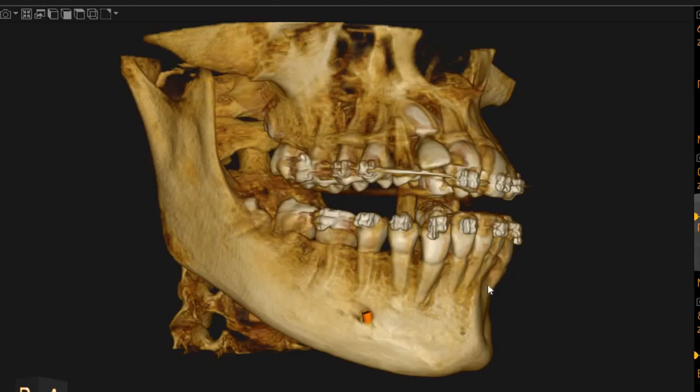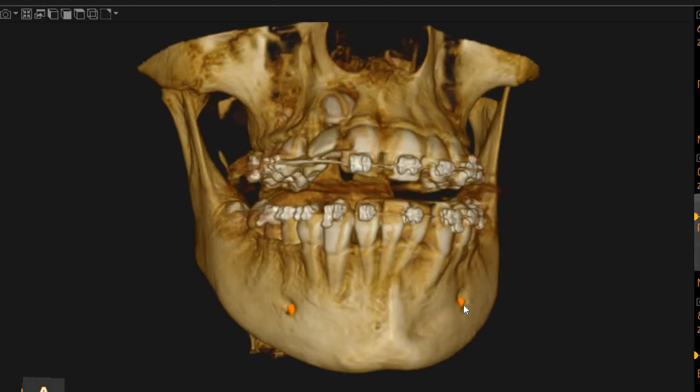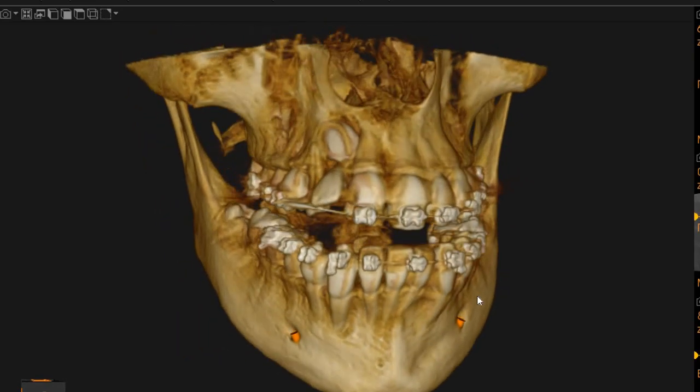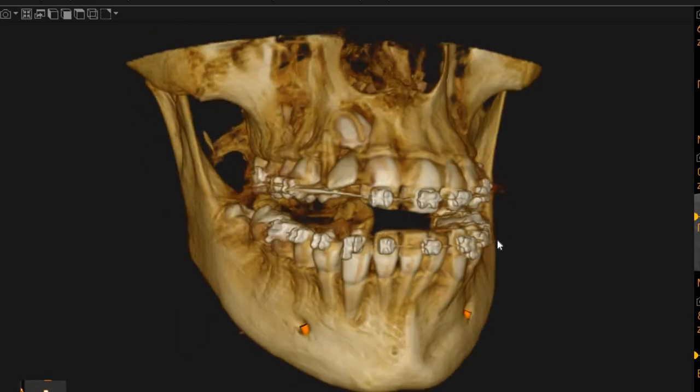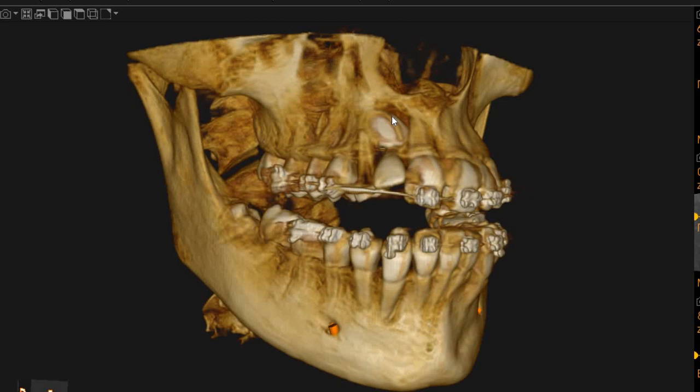Assalamu alaikum, Ultra Scan Diagnostics here. This is the CBCT of the patient that you had requested. The area of interest is the upper right impacted canine.